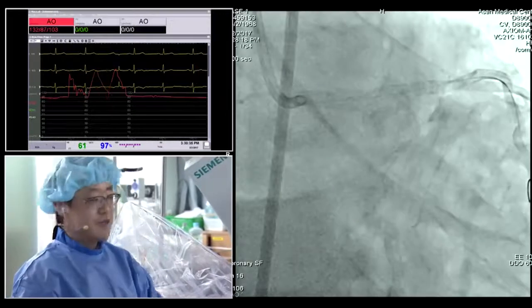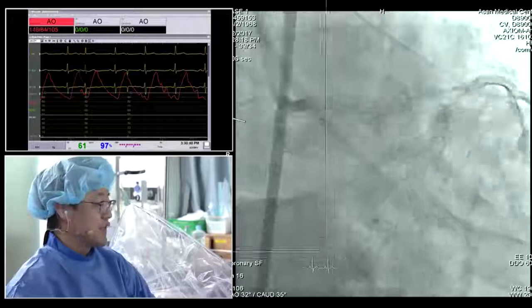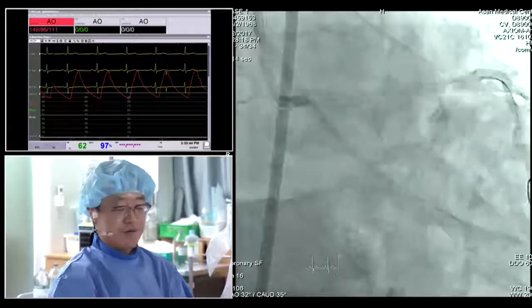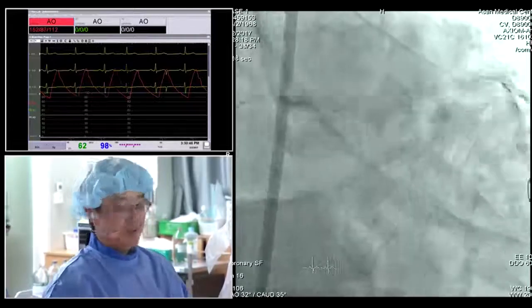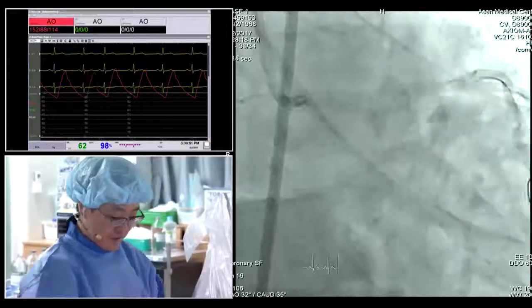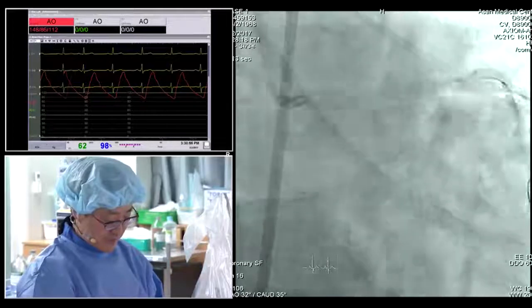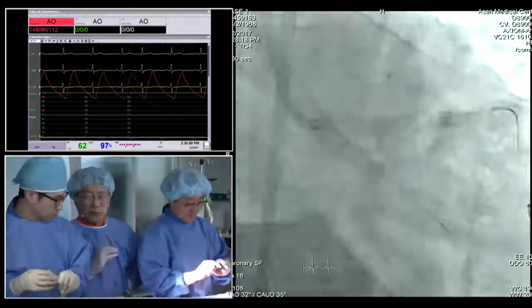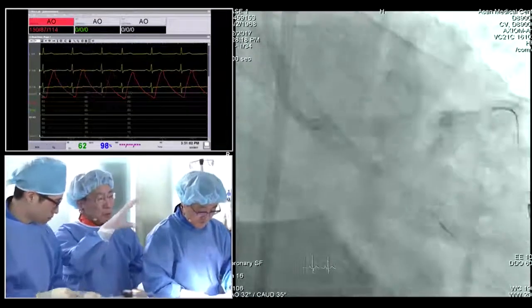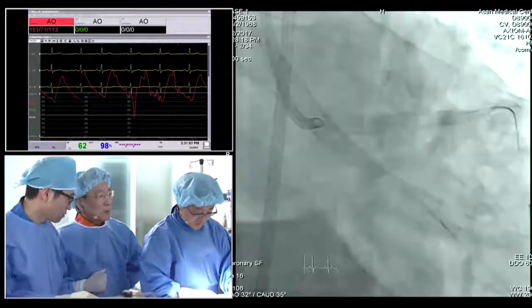Choice wire. The additional balloon is 4, but the original distal size is Choice PT. And basically the disease is very much calcific disease, right? So the left main is heavily calcified. With 4 hyperinflation, still there are some, you know, Yeah, right. All right. I think it's okay.